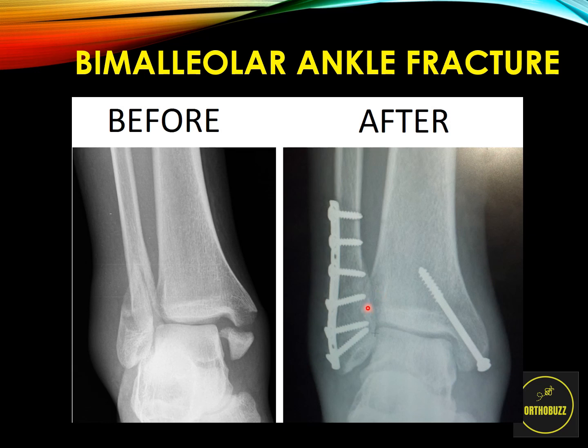If the syndesmosis in the operation has been stressed and it is still unstable after fixing the fibula, then we would need to put a long screw or some form of fixation across the syndesmosis, like we saw with the Weber C ankle fracture, to fix that syndesmosis. So if this Weber B ankle fracture had a Weber C component as a fibular fracture, we would then, by definition, be putting some sort of fixation across the syndesmosis because that syndesmosis would be unstable.